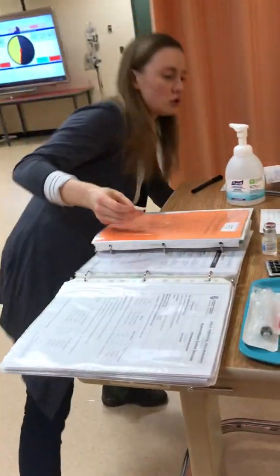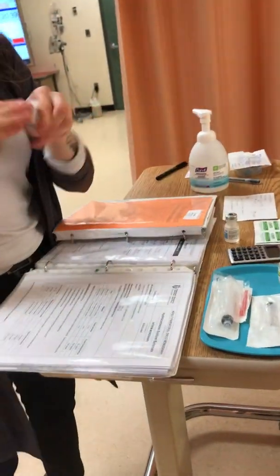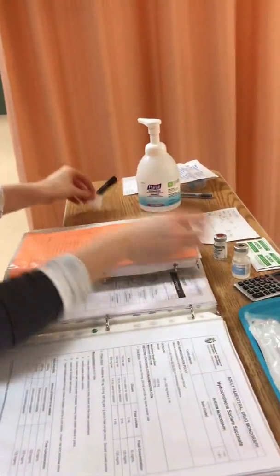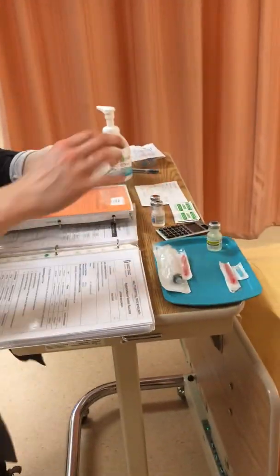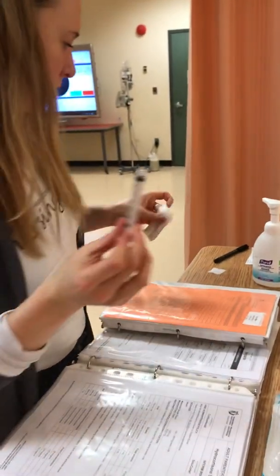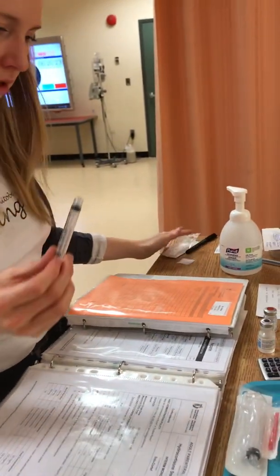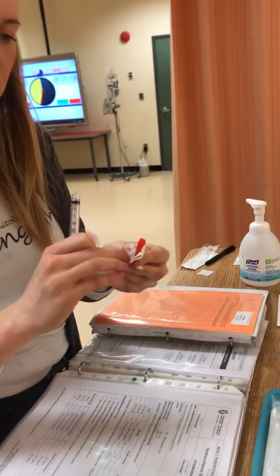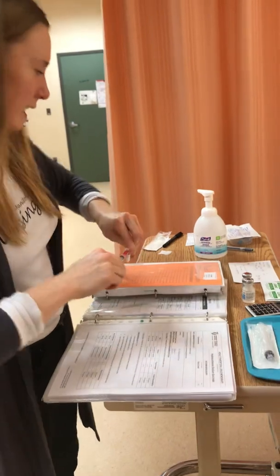The first thing I do is clean this for 30 seconds and let dry for 15. I'm going to quickly check that they're both not expired. They're both good, they're not expired. I'm going to be doing this with a 3 milliliter syringe, so butterfly, pulling this back to get the 3 milliliter syringe, attaching.